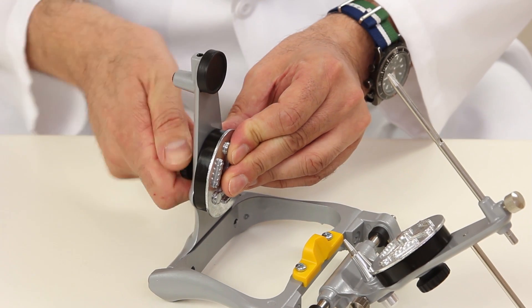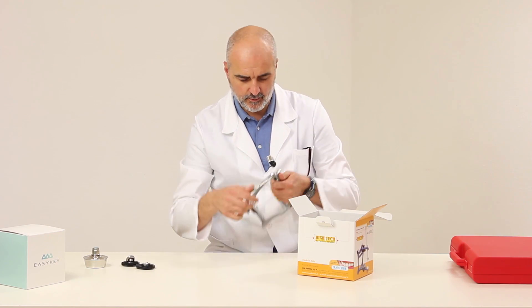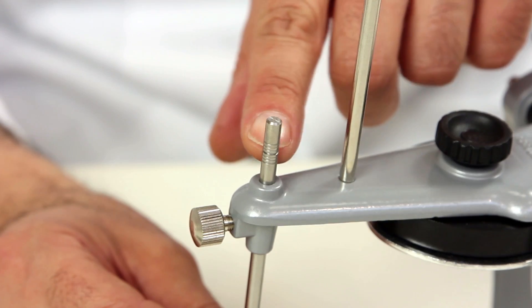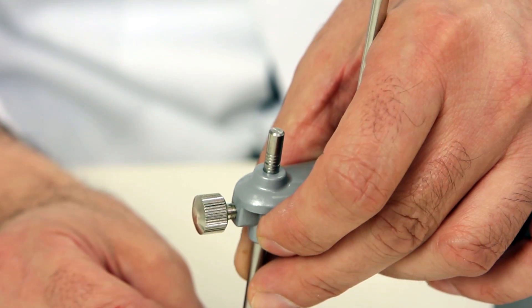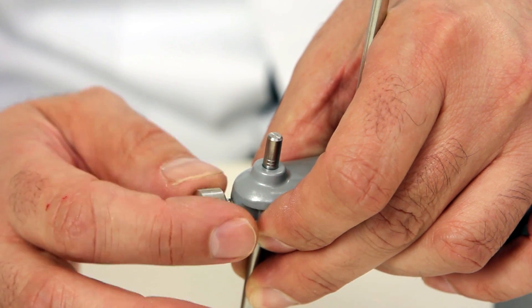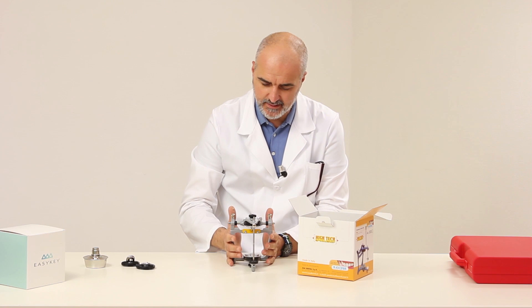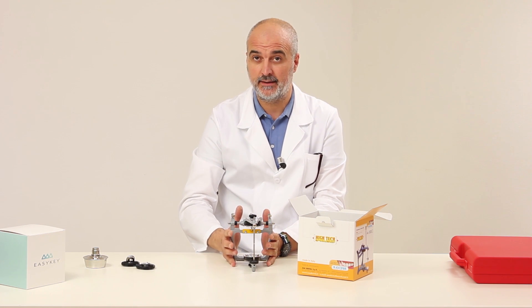The same is done for the lower part of the articulator. Then, there is the graduated rod with zero in the center. It is important that when models are plastered, the rod be positioned on zero. At this point, we are ready to plaster the models.